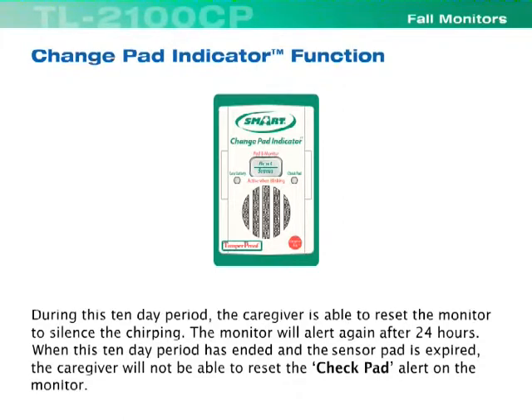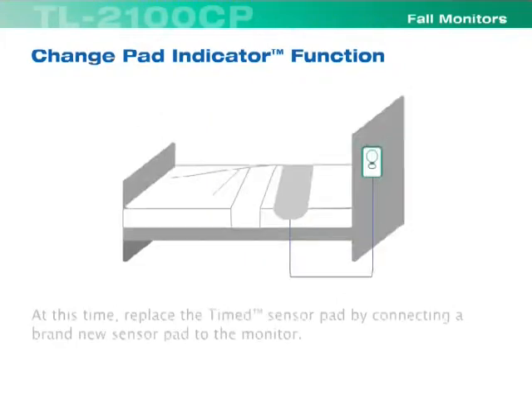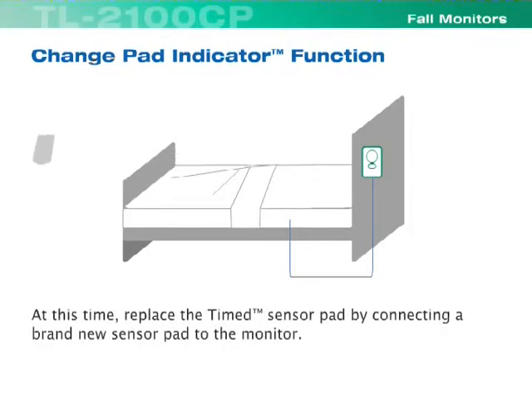The monitor will alert again after 24 hours. When this ten-day period has ended and the sensor pad has expired, the caregiver will not be able to reset the check pad alert on the monitor. At this time, replace the timed sensor pad by connecting a brand new sensor pad to the monitor.